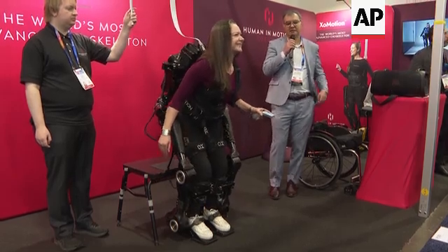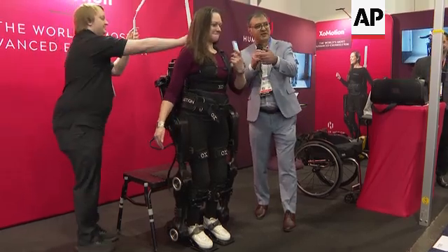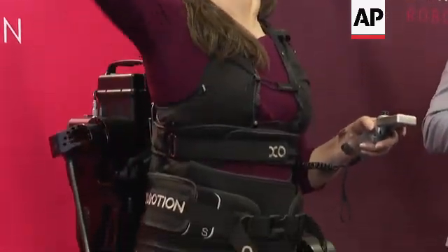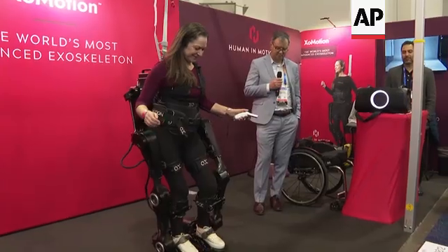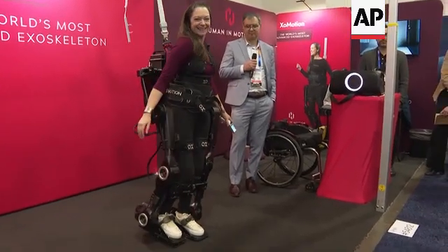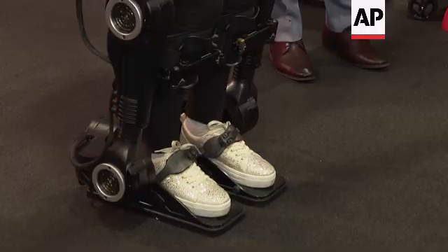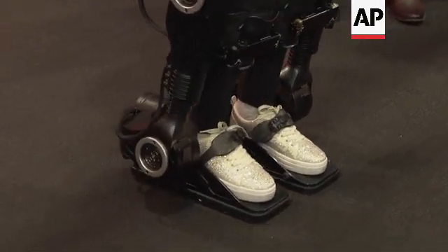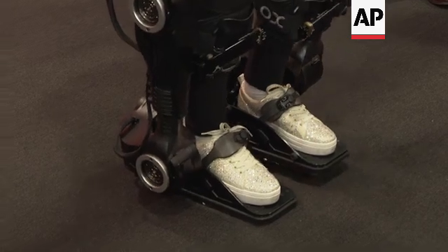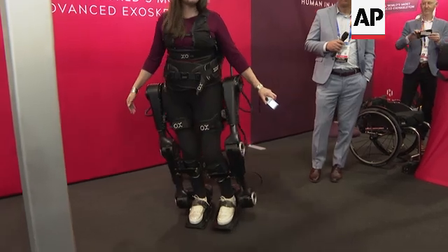As you can see, we have a very user-friendly joystick, and Chloe can select. Will allow me to walk around. I also wanted to point out that I have this overhead harness, but it's really just a safety harness. And you can see how incredibly balanced this exoskeleton is. Fully self-balanced, going through to my natural hip, allowing me to move really naturally.